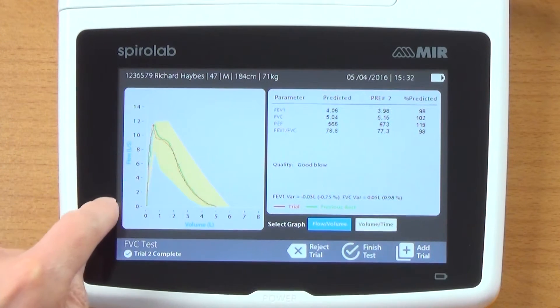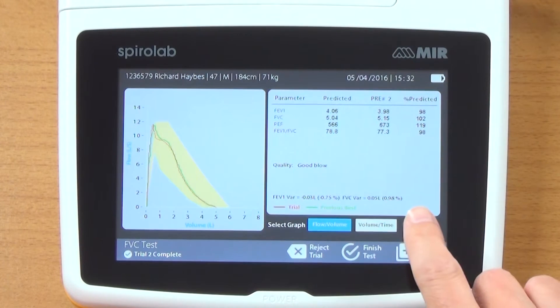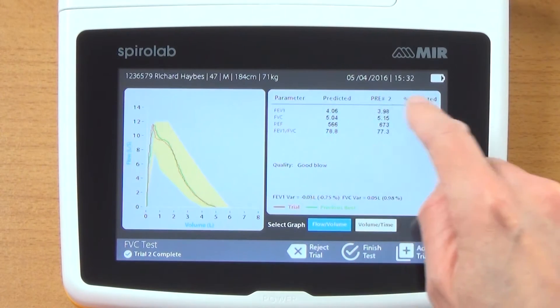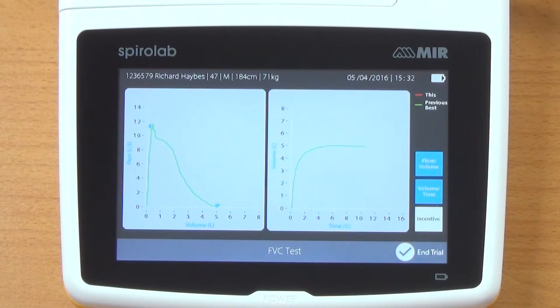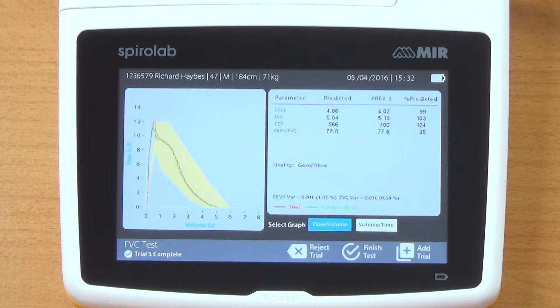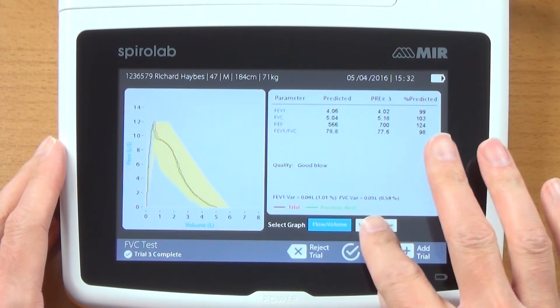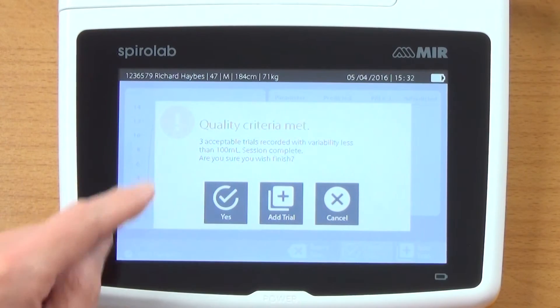We now have two graphs overlaid — pretty reproducible, both within the predicted area. Variation is shown: 0.98% for FVC and 0.75% for FEV1, compared to predicted. I'm going to go on and do a third one. Trial three completed — graphs are overlaid, reproducible, no variation. The actual percentage variation is pretty reproducible and that's compared to predicted. I'm happy with that — I'm going to say finish test. Again it tells us we've met the criteria.